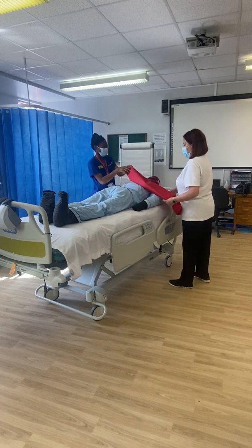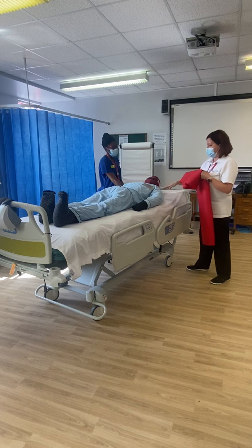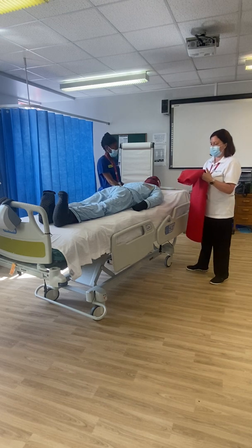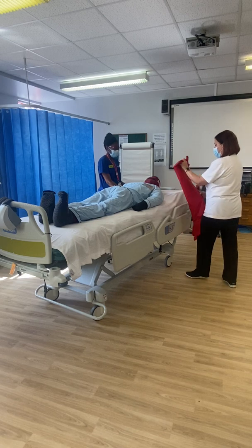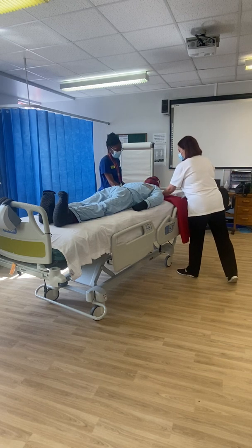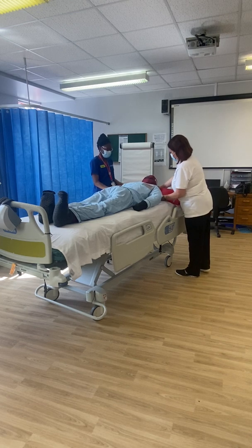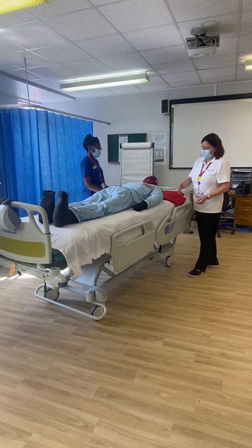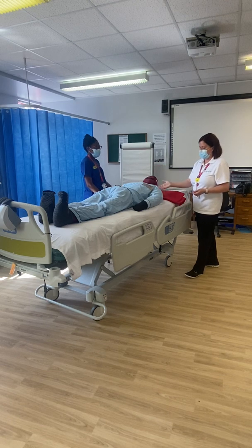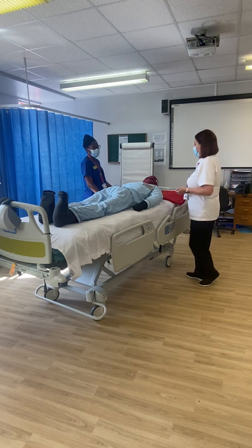Go up to the top of the bed, and then there is a natural gap that occurs behind the patient's neck when they're lying down. So we're going to feed this slide sheet underneath the neck by pushing down into the mattress and sliding it in. So make sure that you've got equally the same amount of slide sheet either way, but it covers to the top of your patient's head and it's just tucked underneath the patient's shoulders.